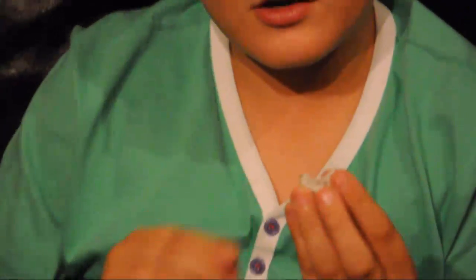Then just get a piece of kitchen towel, cloth, and just dab it, just in case any other insulin comes out or any blood. Shouldn't do though, it should just leave a little mark and that will heal up within the next hour or so. And that's just the little plastic cannula that's been staying in me, and that'll stay in you for 3 days.